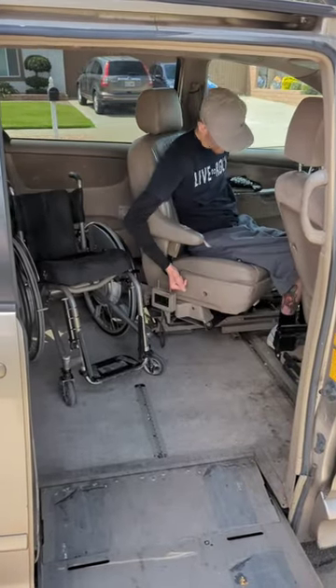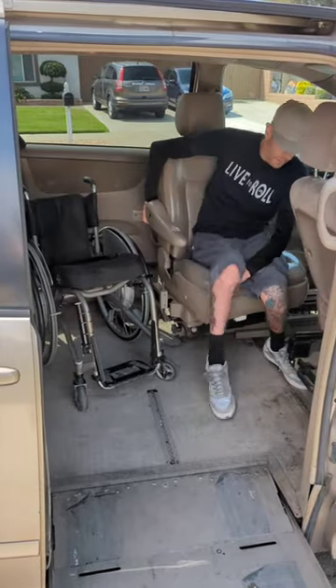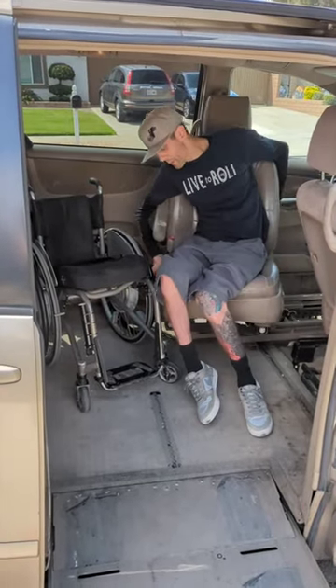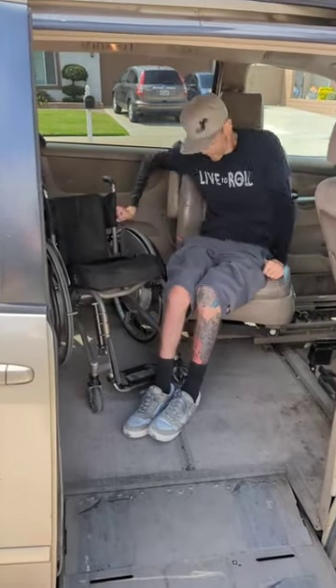When I'm getting out of the van, I'm just slowly working my legs around and through the tighter space between the seats. Once I'm around, I just adjust my legs and get my feet into place.